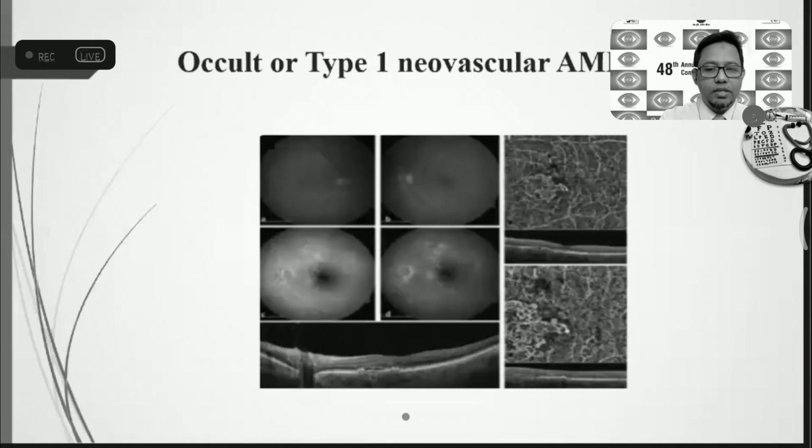I want to show some clinical interpretations now. Here are the color fundus photography and the early and late phases of fundus fluorescein angiography, and OCT angiography. My cursor is not working now, so I cannot point. Fundus fluorescein angiography shows a small change in the macular reflection. In the early phase there is non-homogeneous hyperfluorescence; in the late phase, hyperfluorescent staining but no obvious leaking. OCT shows a irregular PED with mild subretinal fluid.